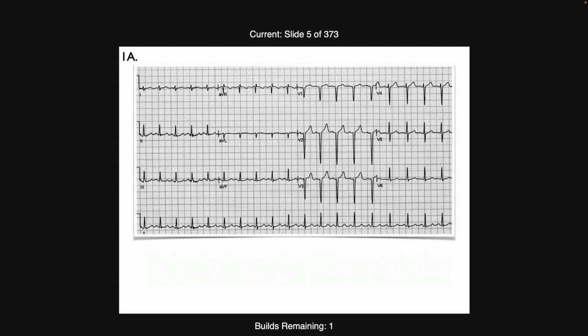And what was kind of interesting about this, I have no idea if anybody's bumped into this because I've never heard it from another student, but a few years ago, there was a student who was in clinicals and said the nurses place the electrodes a little different, and they place V1 and V2 too high. I had no idea if it was all the nurses, one nurse, whatever. And I was like, I have no idea why they would do that.